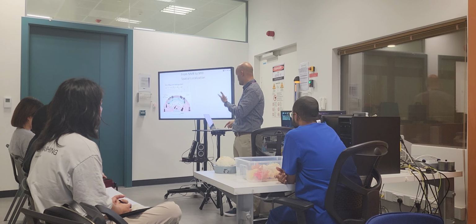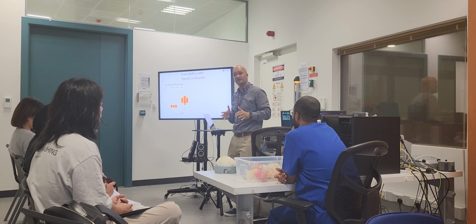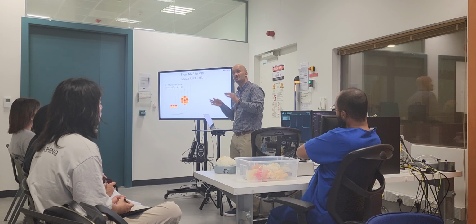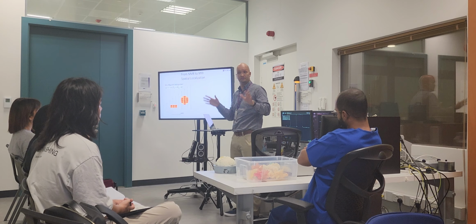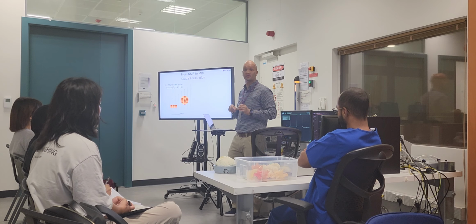So it's very similar to an orchestra. I make the spins sing at different frequencies depending on their spatial location. That's all that we're doing with adding a gradient. That's half of the Nobel Prize 2003.